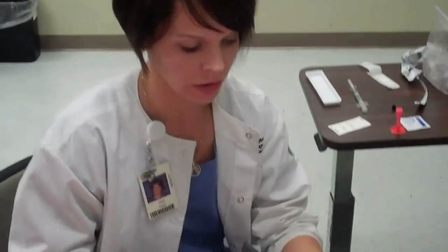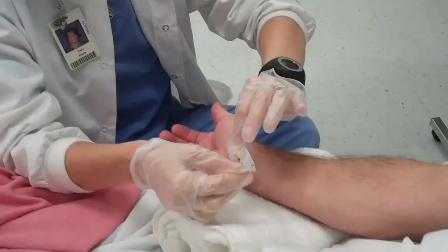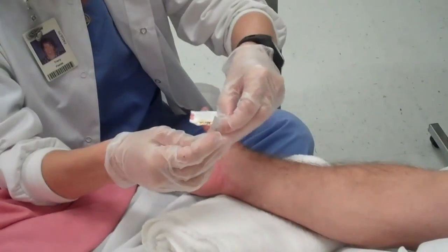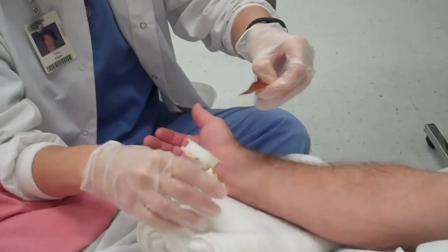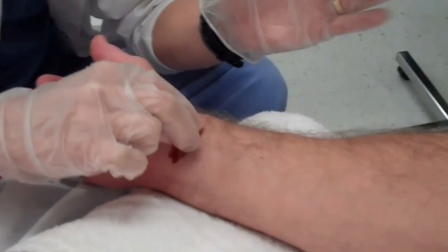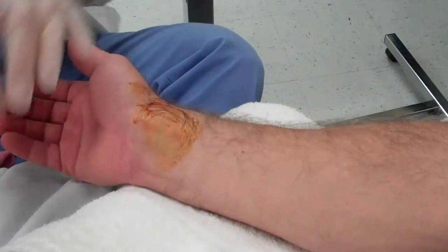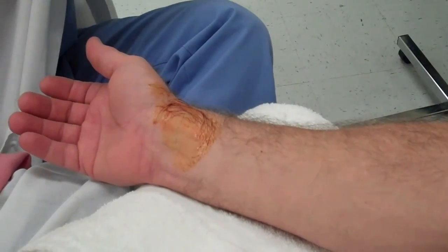This is ABG Part 3. I'm now getting ready to actually do my puncture. I'm going to prepare the site. I'm going to take it and find a circular motion, starting in the center and working my way out. This stuff is messy so be careful at the bedside.